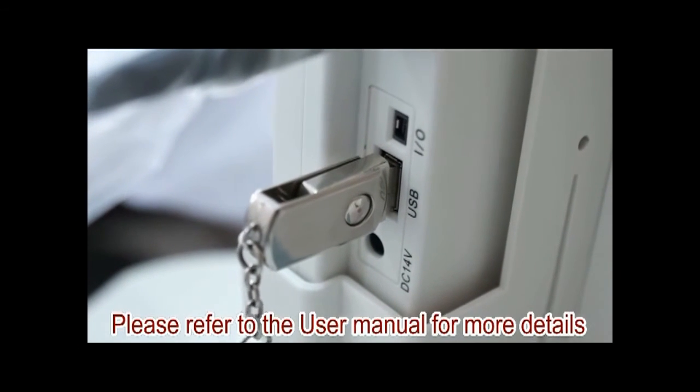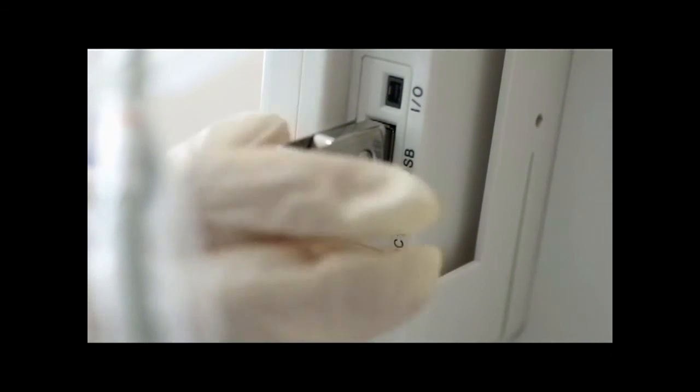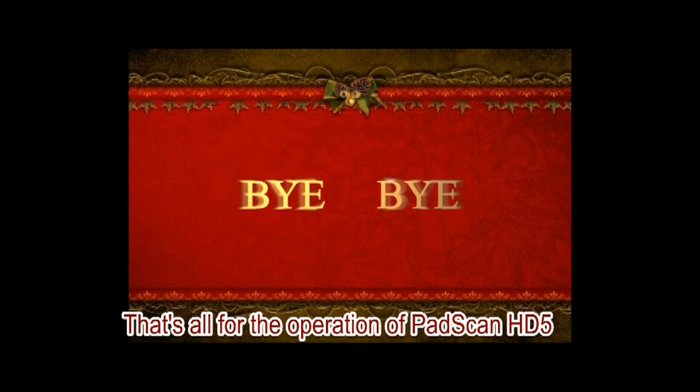Please refer to the user manual for more details. That's all for the operation of PadScan HD5.